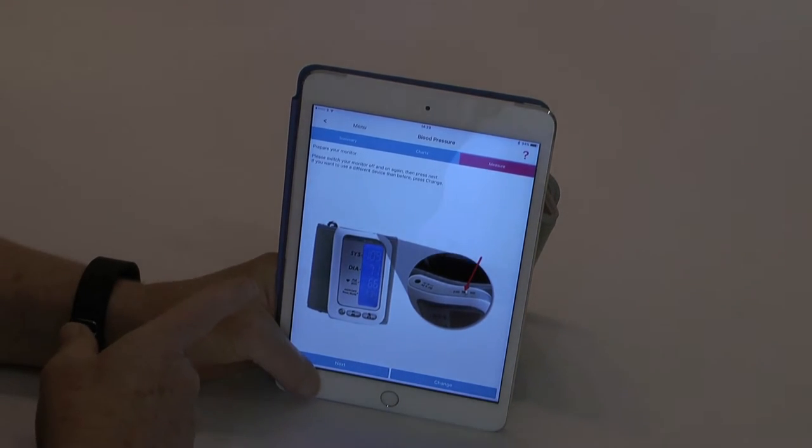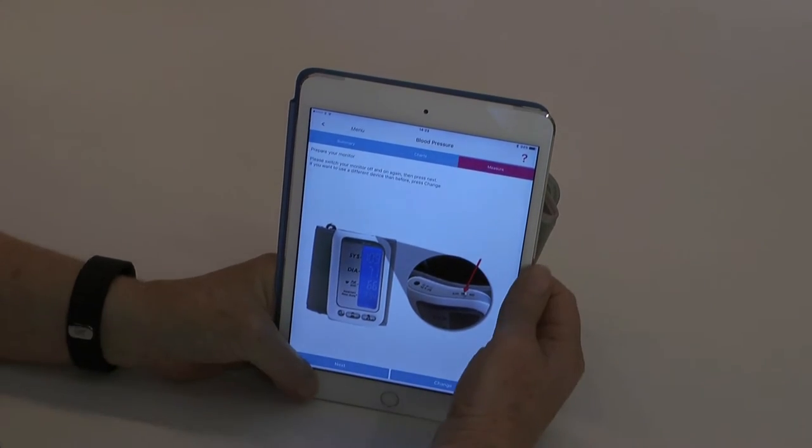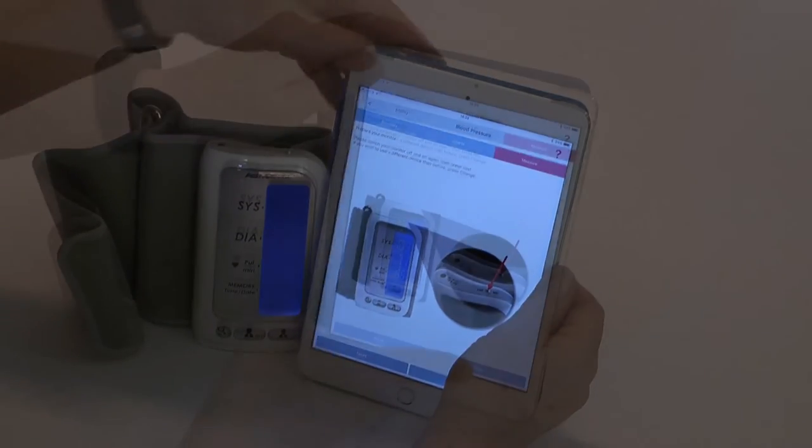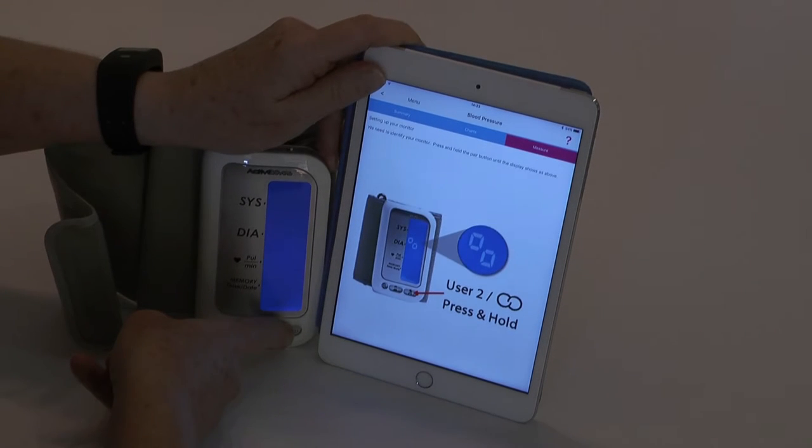First instruction is to turn on the device and associate that particular unit by pressing the user 2 button until you receive the symbol.